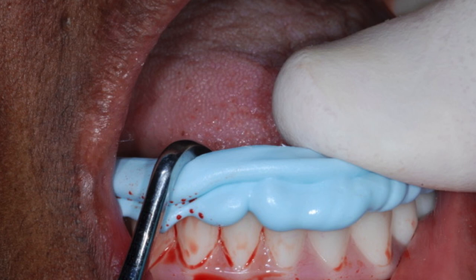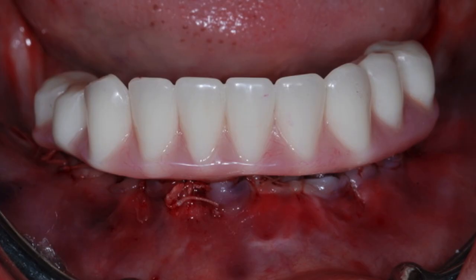Right. But once you get your initial alignment of the retentive insert on the abutment itself, you can also even see it. You can also get an initial seat of it. Mm-hmm. But this little device will pull it down harder. And it's a thud once it happens. It's like a thud sound. And when that clips in, with the medium to heavy retentive structures, they're not coming out. It's not going anywhere.